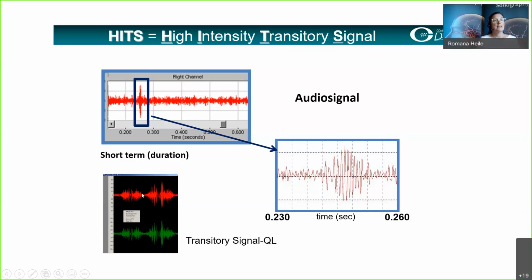That means these are two different calculation methods to look at the same event. This is done with sinus and cosinus, or let's say the I and the Q signal. So two different calculations to look at the same thing. And if it's supposed to be an embolus, then we will see a similar pattern in the red and green signal.